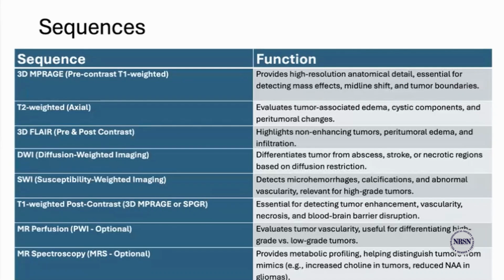Again, we will also still do a T1 post-contrast, the same one that we ran as pre-contrast. So our radiologist would prefer if you use the same sequence so that it's more uniform and they can actually compare side to side without having to change any parameters.